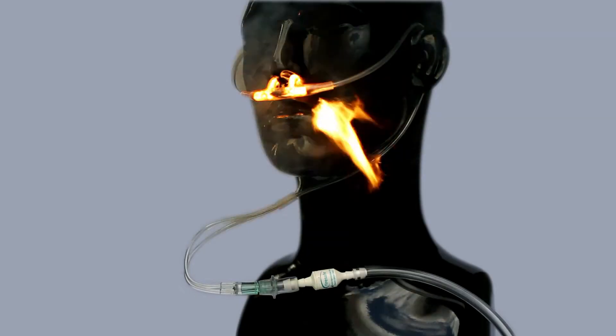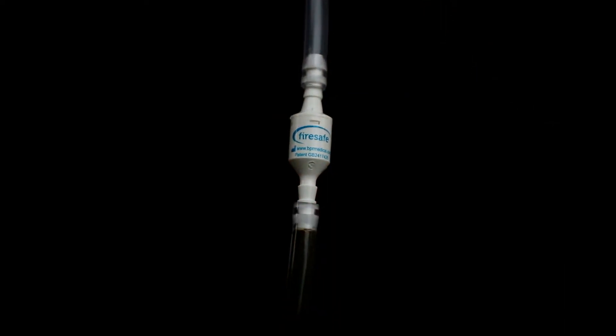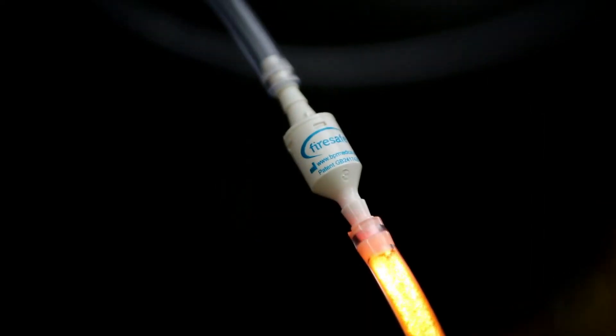Patients should be advised never to remove fire brakes. Where a humidifier is used, a fire brake should be installed close to the humidifier outlet.